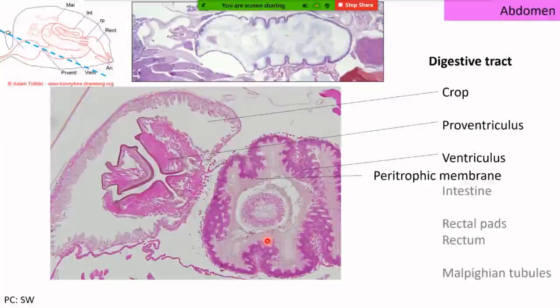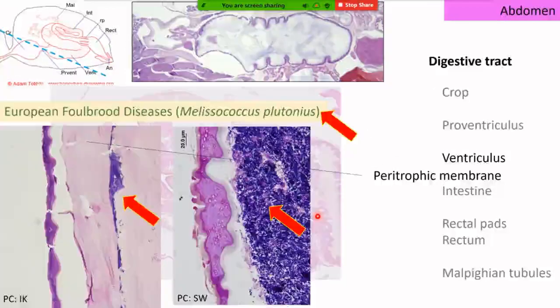First, it mixes the digesta with the enzymes and therefore stimulates the digestion of the food that bees take up. But also, it protects the ventricular lining from any physical and mechanical damage that bees can take from the pollen. Ventriculus is an important organ to investigate in some bacterial diseases in honeybees.